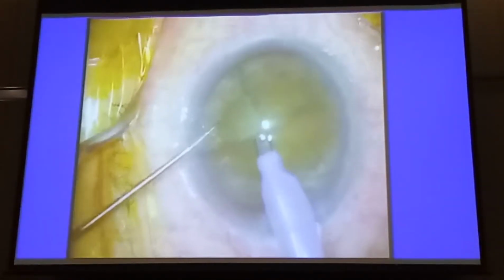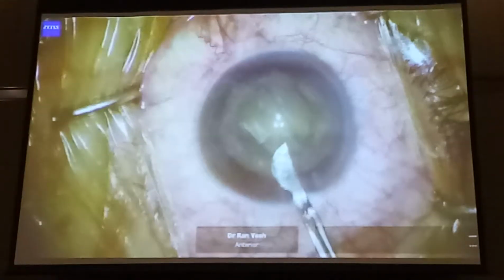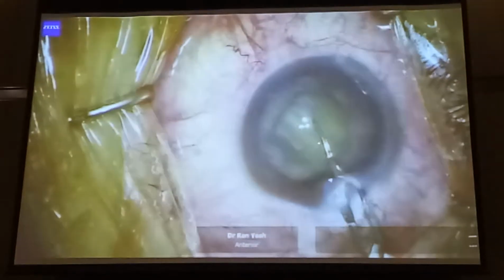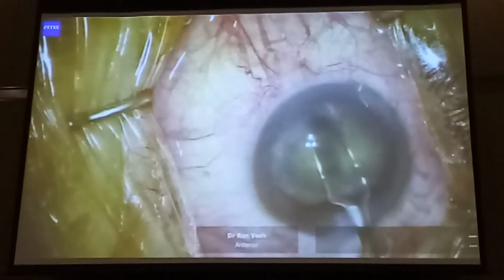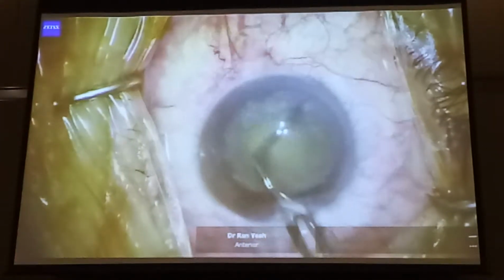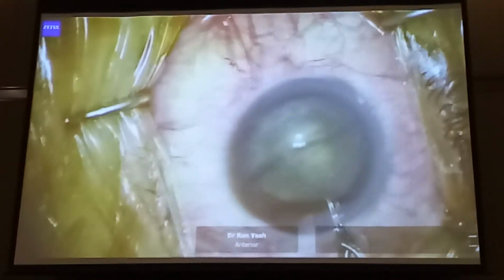it very, very effectively. Okay, so the combo 2 pre-chop is safer for soft nuclei, what I call the neither here nor there nuclei. I think tomorrow or on Saturday, Panet's going to talk to us about soft cataracts, and I think that direct karate pre-chopping is actually one of the very nice techniques for doing this. So actually this is the combo 4, that was the combo 2. This is the new combo 4, you can see it's much thinner. This is an 85-year-old lady with probably a 3+ nucleus, and you can see that this new pre-chopper is able to crack 2 to 3+ nuclei very, very well as well.